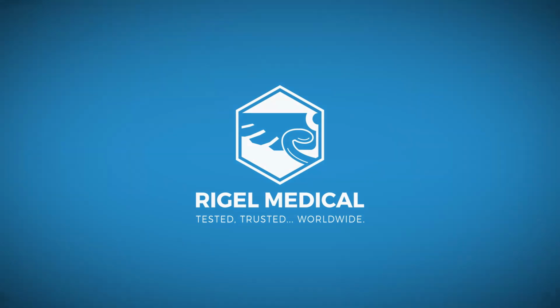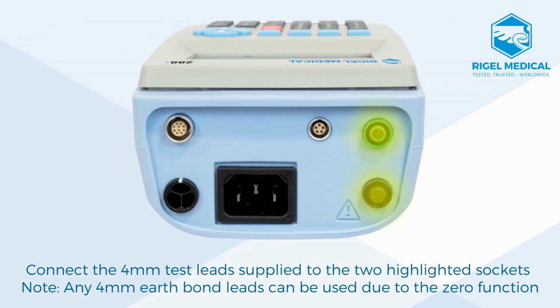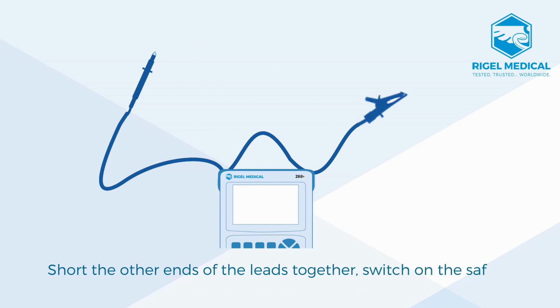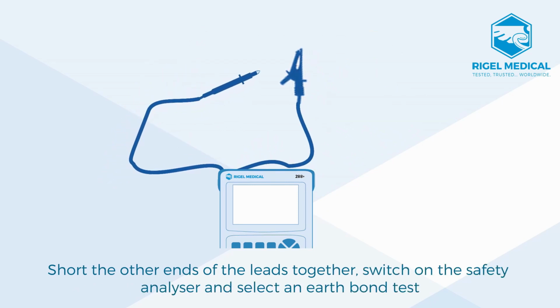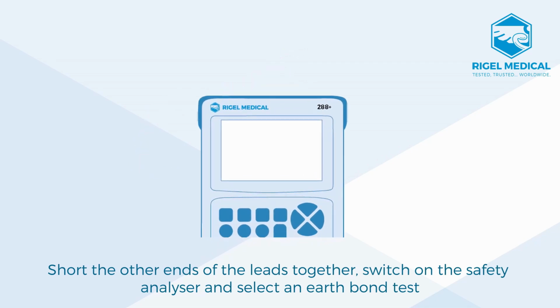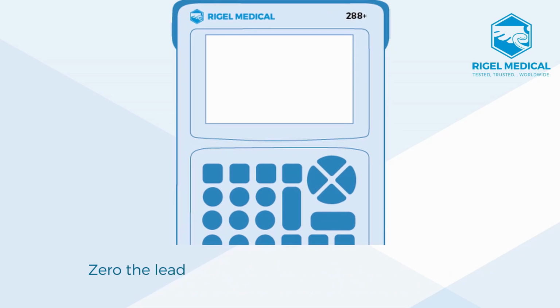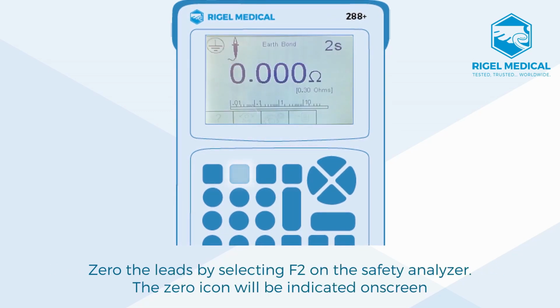So first we connect some 4mm test leads that's applied to the two highlighted sockets. So any 4mm earth bond leads can be used due to the fact that the Rigel 288 device has a zero function. And then what you can do is short the end of those leads together, switch on the analyzer and select the earth bond test. Because you've shorted these leads together, you can then zero them out using the F2 function. And the zero icon will be indicated in the top left once the zero has been performed.